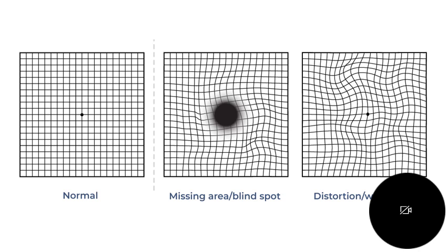This is just a quick note to let you know that oftentimes in an emergency setting, when someone's vision is affected, a good way to tell if the problem is with the optic nerve or with the retina is to use the Ishihara color plates and the Amsler grid.